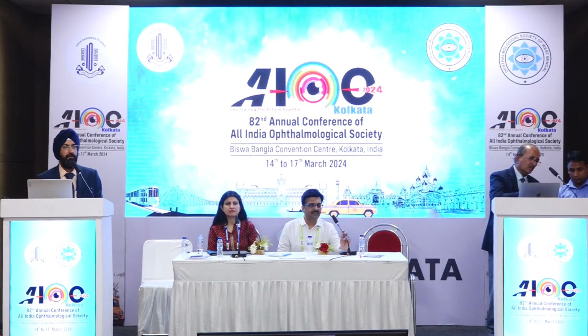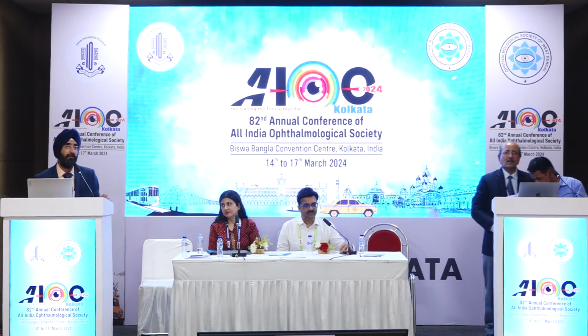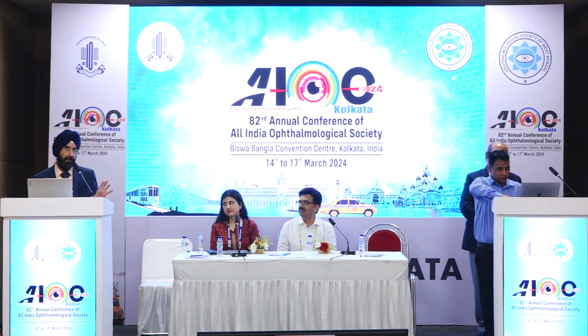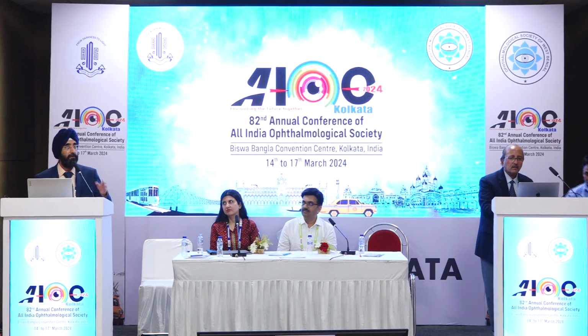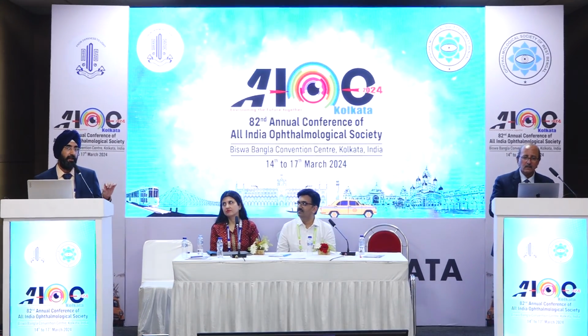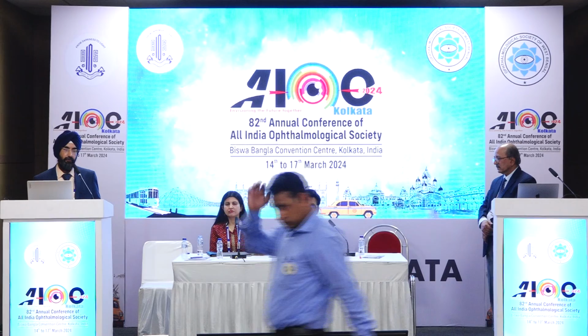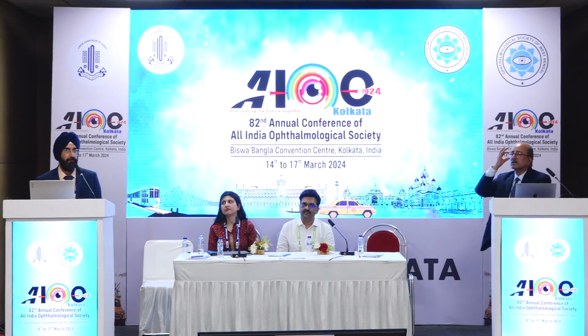Yeah, in the literature you have single piece also. They have done single piece toric IOLs also in children with posterior optic capture. But because it has a broad optic-haptic junction, it really becomes difficult there. But you have single piece IOLs with a thin optic-haptic junction, and rigid PMMA IOLs with a thin junction. You can do that. People have described doing that. So if you have a thin optic-haptic junction, yes, you can do the capture. It's not a must.